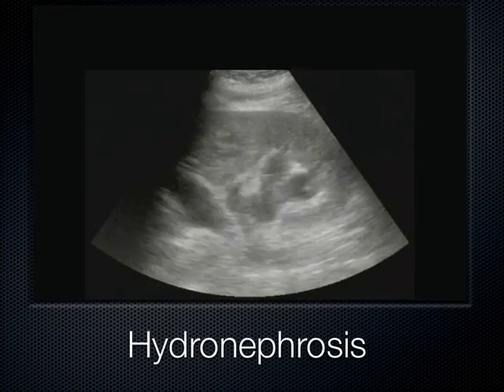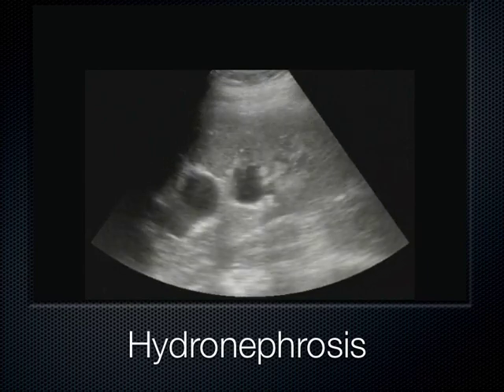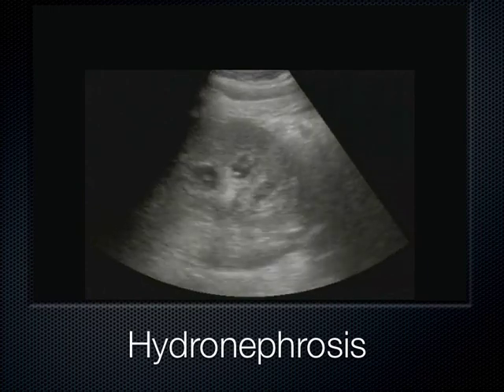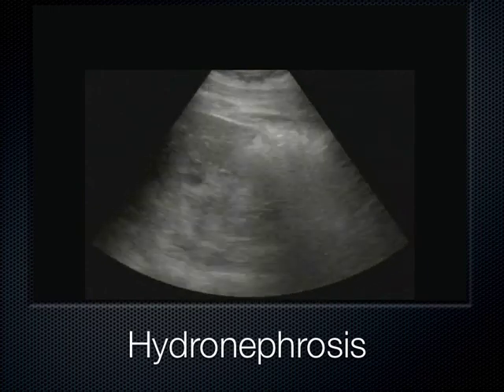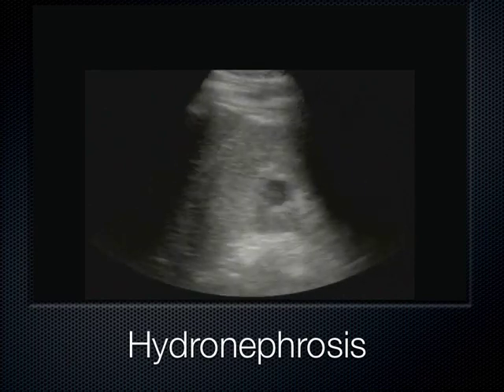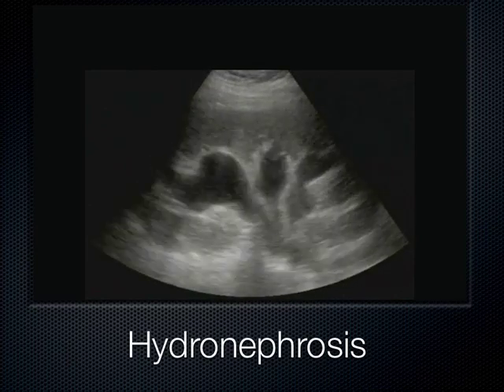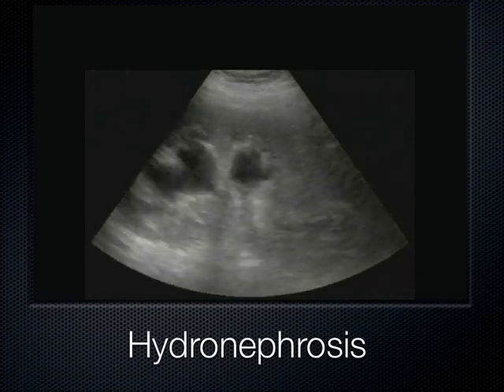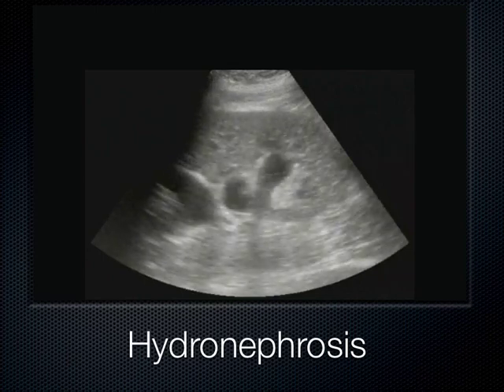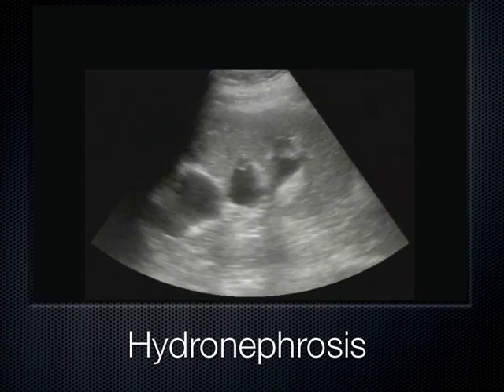But you move on, you see a little bit more. We can see the fingers of the glove going out into these different projections. They eventually all coalesce, but not until we get right to the renal sinus. So that's another mild amount of hydronephrosis. It's a very nebulous grading category, but here it's splaying out a little bit, sort of mild. We can still make out plenty of cortex. This is all cortex out here. There's plenty of cortex left in that kidney.